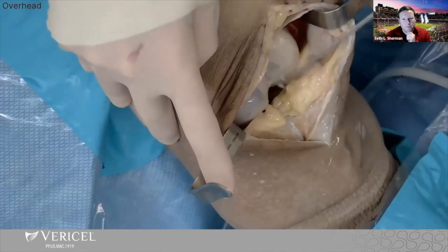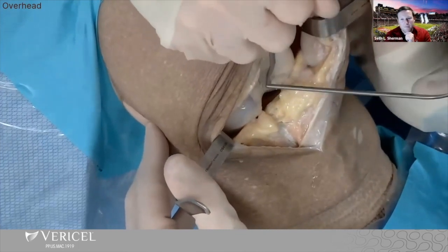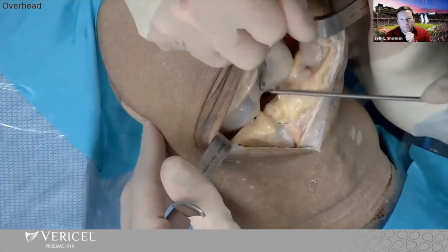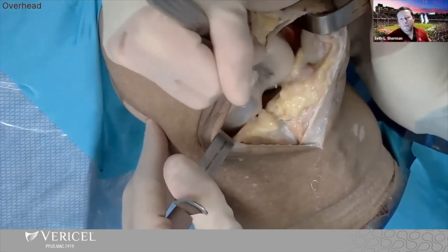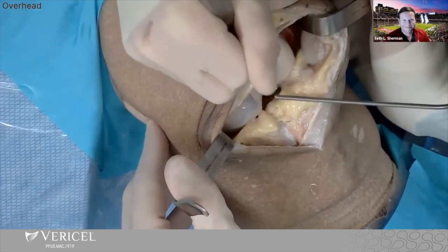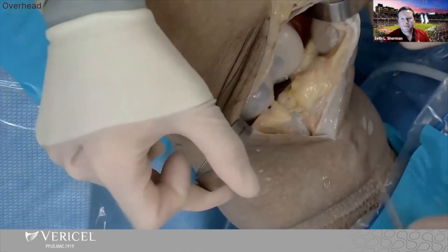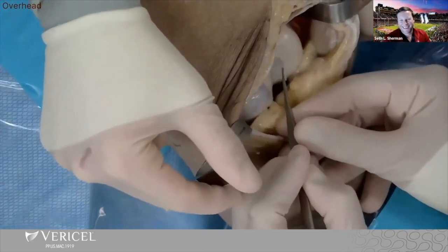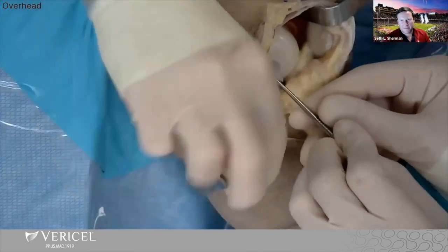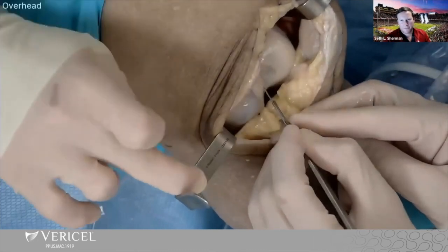One goes above, one goes below — we take turns and use suction, which is efficient. The key is to constantly make sure you're staying right on that border. Do you ever use a 15 blade anymore? You're beating me to it! Let me show you how to do the rim. I have this little tool from the hand section — I don't know what it's called, but I love it. It gets that little border on the edges. And then when you really want to finish off with the 15 blade, you want to get that ring right around the perimeter, similar to how you deal with the transplant section.